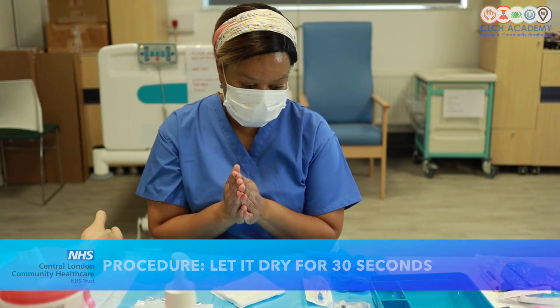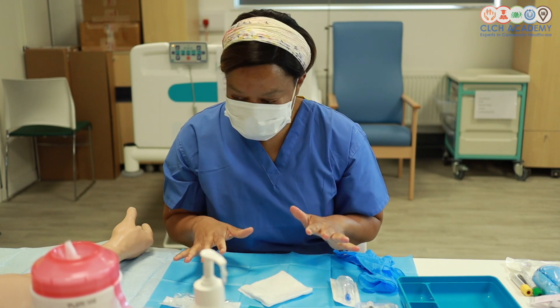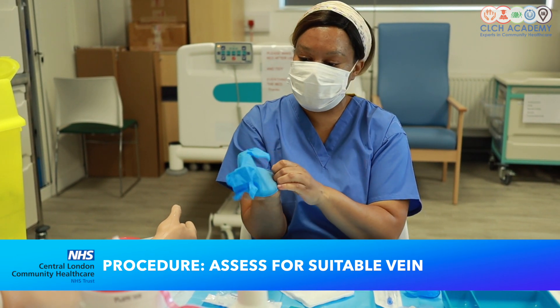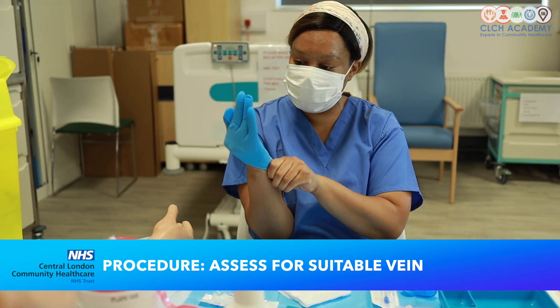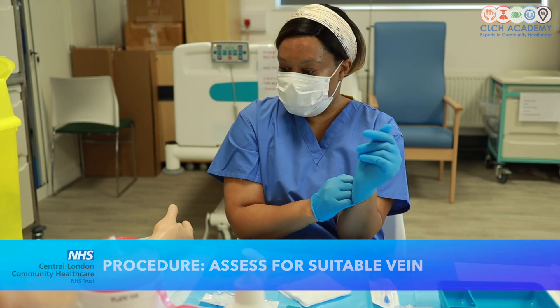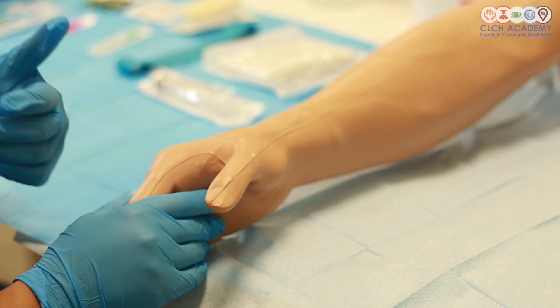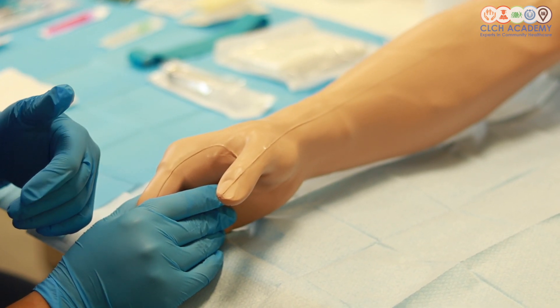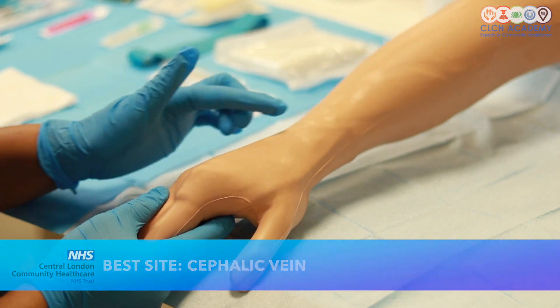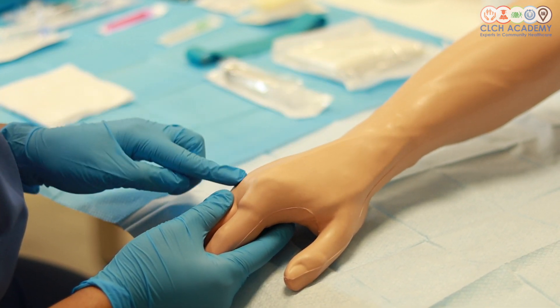Next step after that is I'm going to wash my own hands. Once I've decontaminated my hands, my next step is going to be to feel for a vein. You may choose to wear gloves for that because the patient may feel more comfortable with you wearing gloves. Alternatively, you can do that with your fingers if that is more comfortable for you. I always recommend you do a quick vein assessment before you prepare your equipment so that you know you've actually got a vein you can access. In this situation, I might be headed for the cephalic vein that is aligned with our thumb over here, or alternatively looking at the hand for good veins on this mannequin.